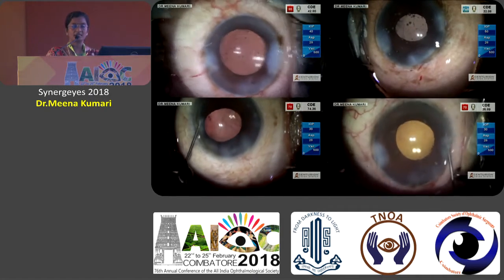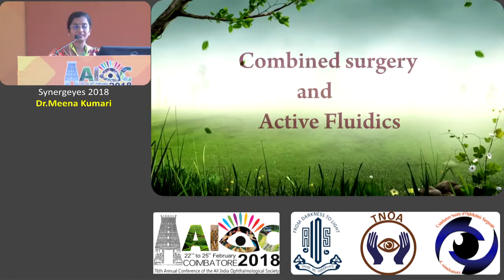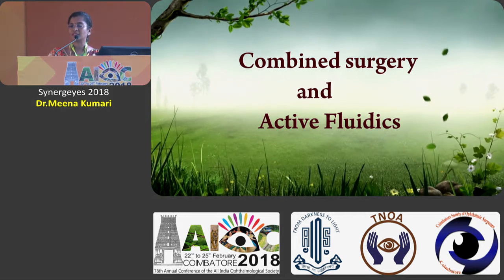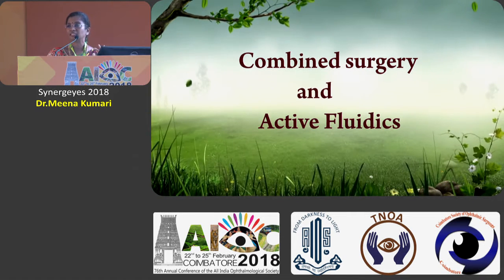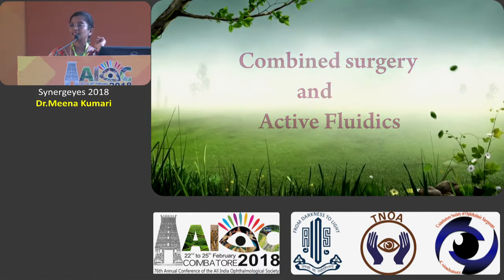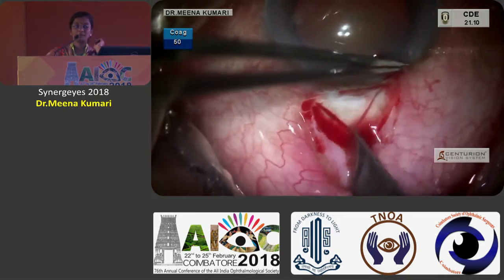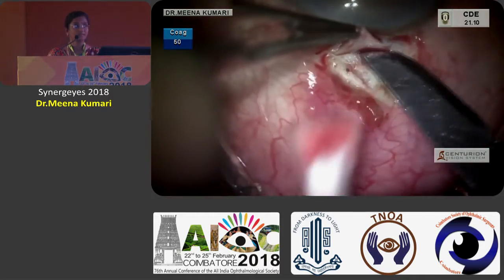And the very next day, the results are very gratifying in harder cataracts. Patients are not willing to wait for a week or 15 days or so for their central SKs to clear and their fibrin membrane to vanish from the anterior chamber. And why should we go for lower intraoperative pressure when we are satisfied with the gravity-based fluidics with the 80 or 85 intraoperative pressure? Yeah, this is a patient with a glaucoma combined surgery with a hard cataract.